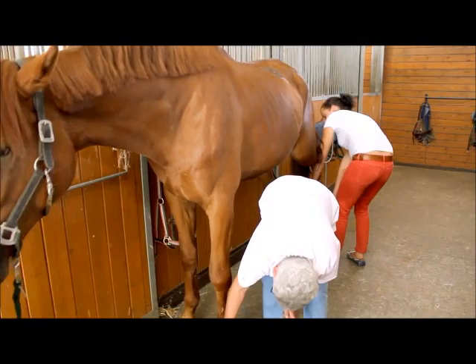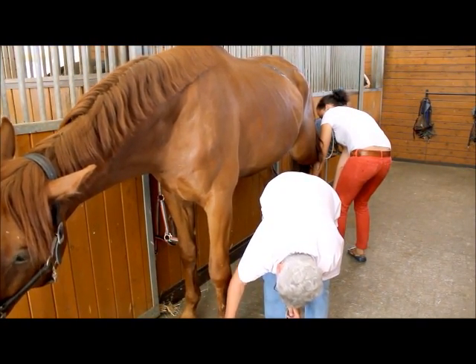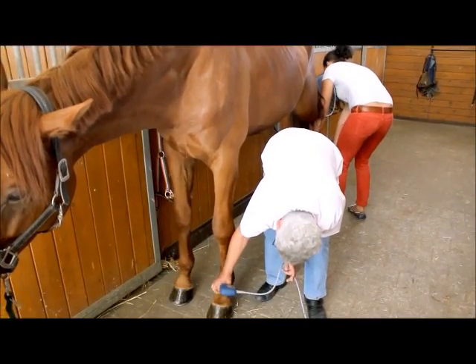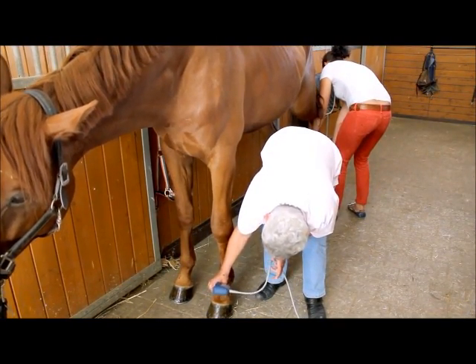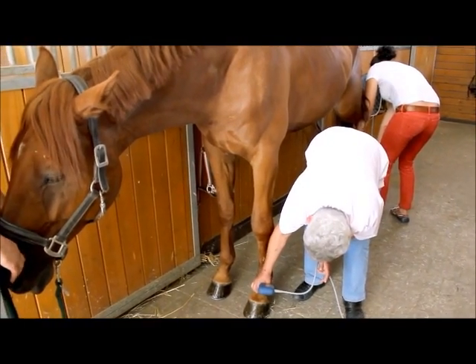So you are also treating sport horses in professional sport? Yes. Mostly I treat jumping horses. I also do dressage horses and eventers.